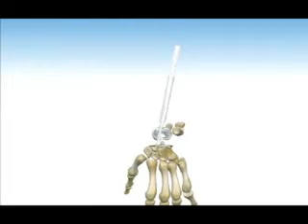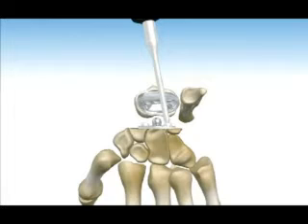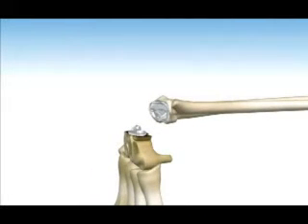Accurately measure the required radial and ulnar screw lengths with a depth gauge. The self-tapping screws are inserted through the carpal plate and into the holes created by the 2 mm drill bit with a 2.5 mm hex driver. Use imaging to determine that the screws are the correct length. The screws can cross the second carpo-metacarpal joint, but not the fourth carpo-metacarpal joint. The screws are then tightened into place.